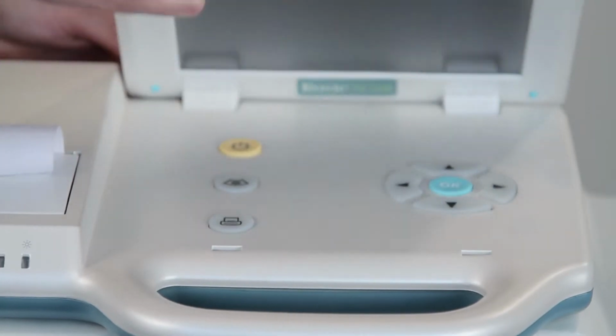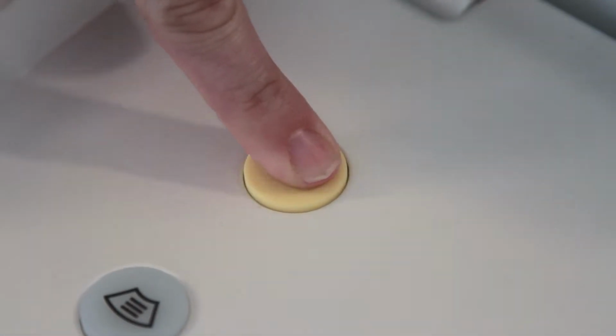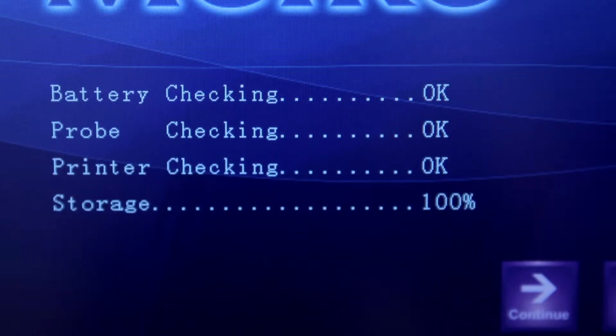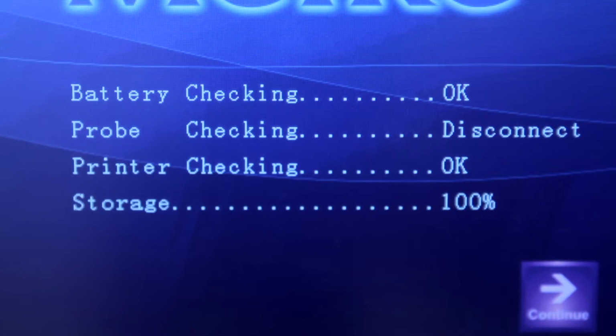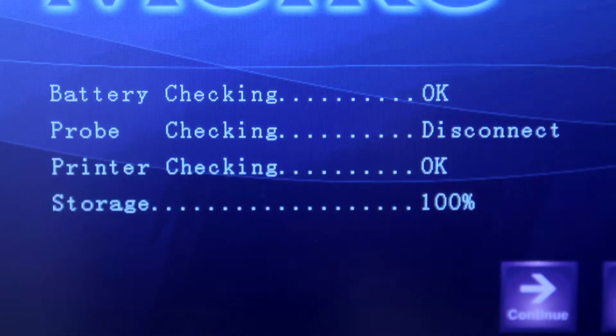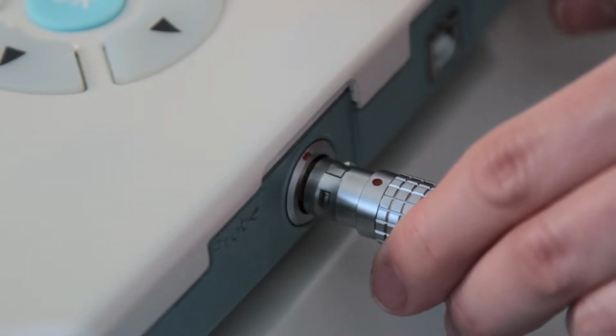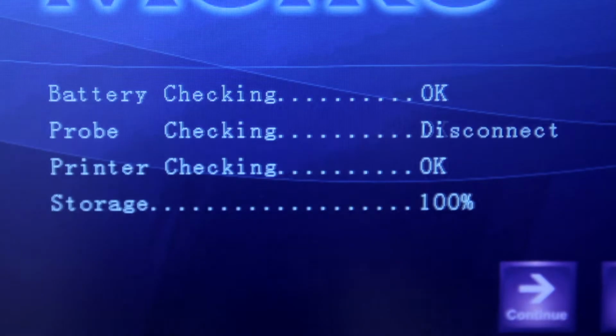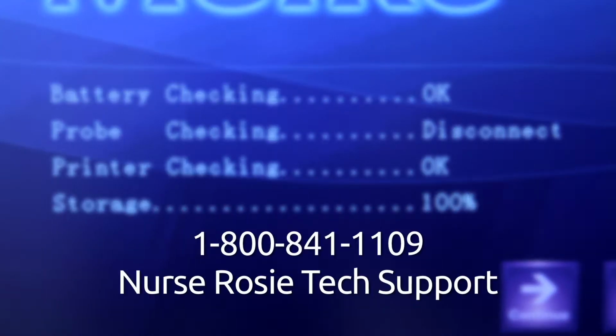To turn on the device, press the power key. The device will automatically check the battery level, printer, probe connection, memory capacity, and screen. If disconnect is displayed instead of OK, check to make sure you have installed the item properly. Self-check will display OK once the connection is corrected. If disconnect still is displayed, contact Nurse Rosie Products Tech Support.